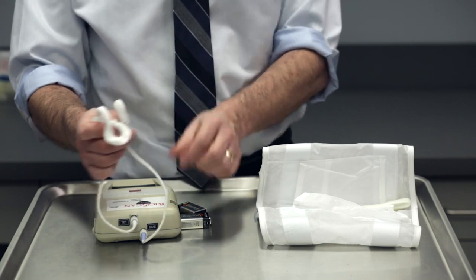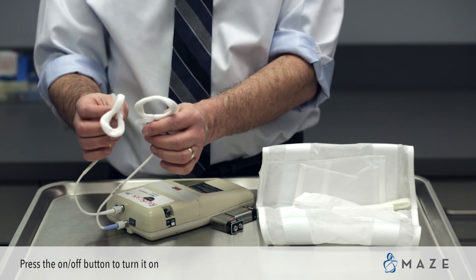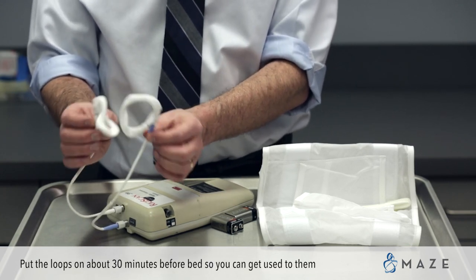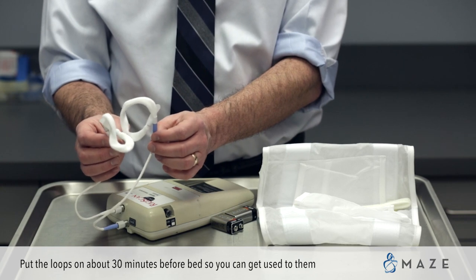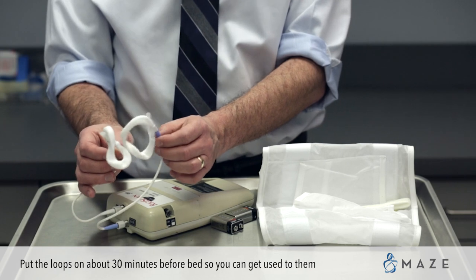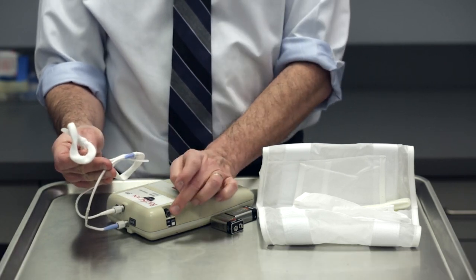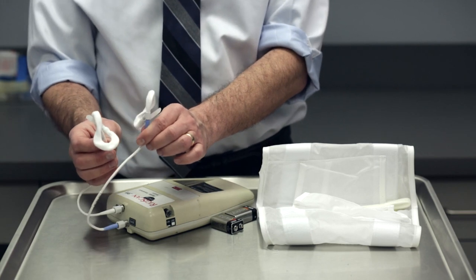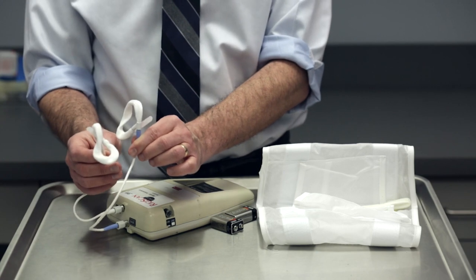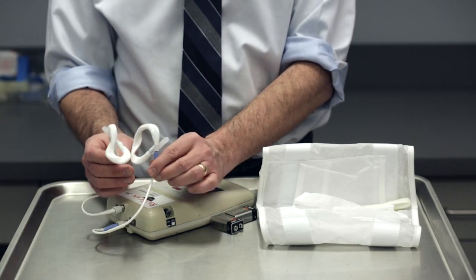Then you're going to press the on/off button to turn it on. Do this right before you're ready to go to sleep — about a half hour before you actually fall asleep. Go into bed and just get used to it so that it doesn't interrupt your falling asleep. You put it on, hold the loops in position, press the button, and they're going to slowly squeeze down until they get a little bit tight, and then they're going to relax, keeping them in position — right behind the head of the penis and right at the base.